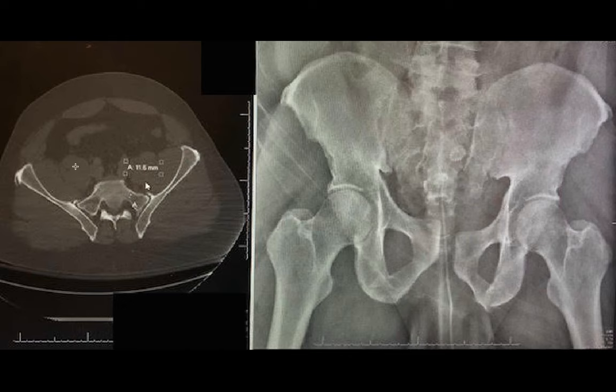Now, the important thing to note about this is that there's a couple of ways that this injury can be addressed, from nothing, to external fixation, to screw fixation, plate fixation, SI screw fixation, and a lot of it will depend on your discussion with the patient and what you think will be the best for them and what will give them the least amount of risk with the most gain.